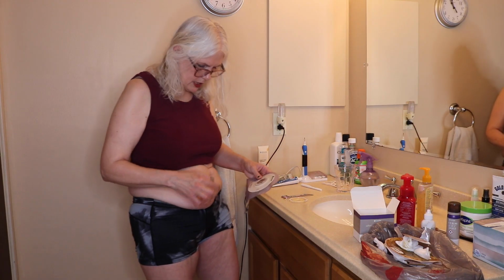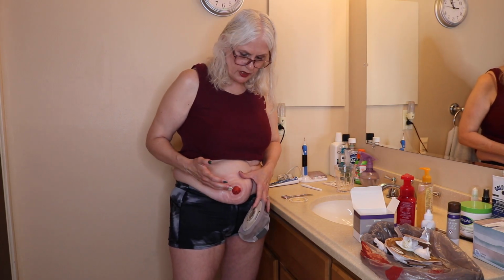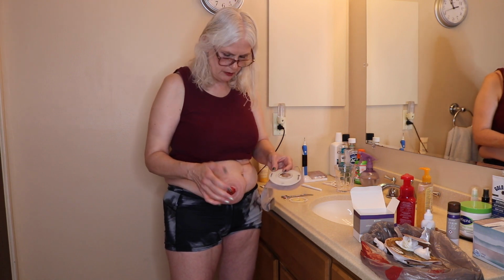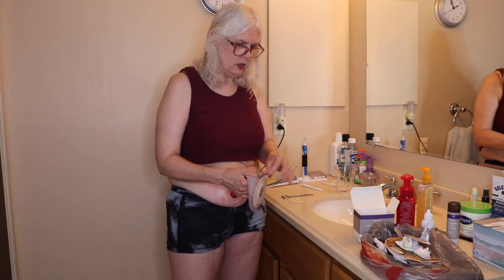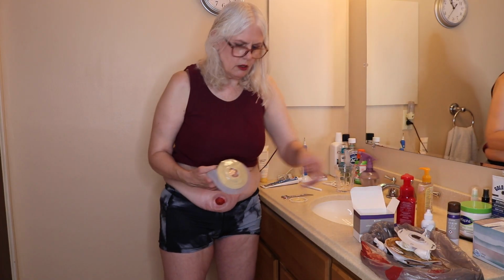The other thing that I was saying was that in cleaning up, also the ostomy is very vascular. So if you nick it, like I've nicked it with my nail once before when I've been cleaning up, it'll bleed a little bit, but as long as it's not profusely bleeding, you're fine. That happens sometimes, that it bleeds. Okay, now that this is good enough, I don't need to cut it any bigger, I will take that off.